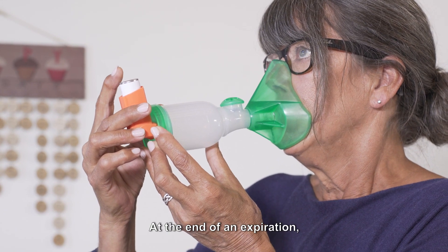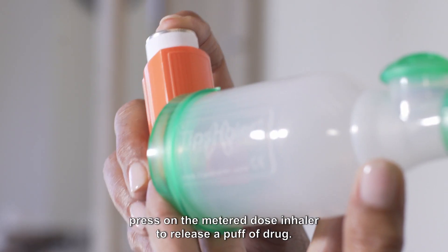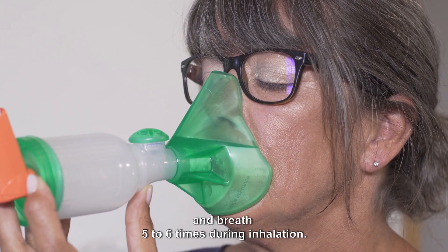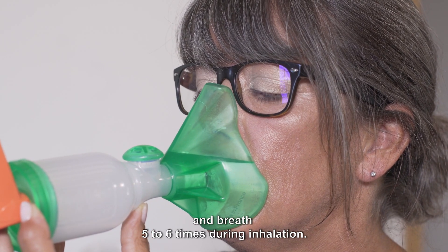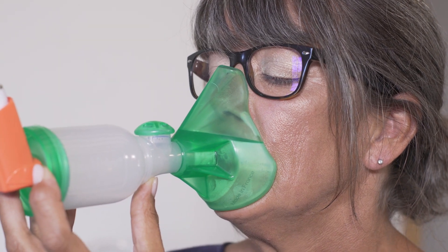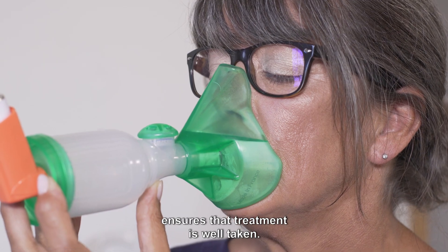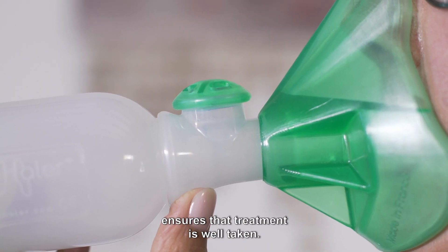At the end of an expiration, press on the metered dose inhaler to release a puff of drug. Keep the mask on the face and breathe five to six times during inhalation. The movement of the expiratory valve ensures that treatment is well taken.